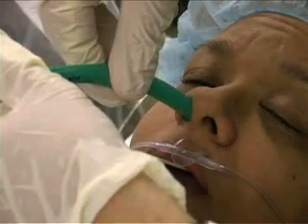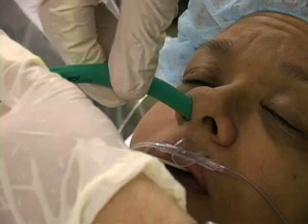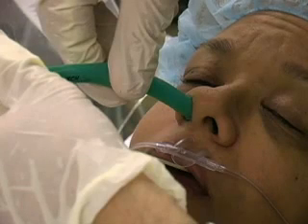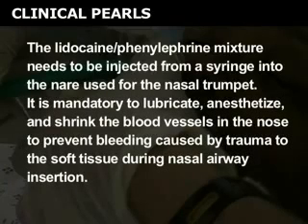Many practitioners perform an awake fiber optic intubation while the patient receives oxygen via nasal cannula. An alternative technique is to place a nasal airway during the procedure. The lidocaine phenylephrine mixture needs to be injected from a syringe into the naris used for the nasal trumpet. It is mandatory to lubricate, anesthetize, and shrink the blood vessels in the nose to prevent bleeding caused by trauma to the soft tissue during nasal airway insertion.